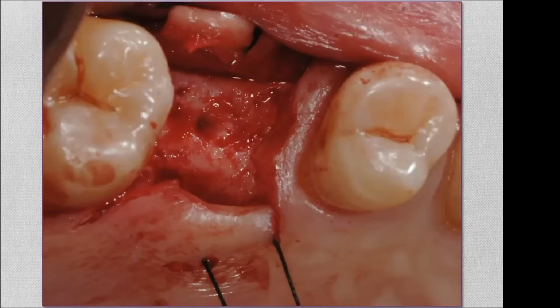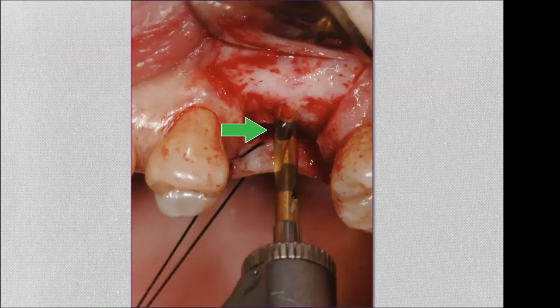okay? We complete our osteotomy, and here, as you see, this is the first black band. So this is 6 millimeter to 8 millimeter. We're getting to about within 2 millimeters of the bottom of this one. So we're at 4 millimeter depth. By our measurements, we have about 5 millimeter depth. So we are keeping 1 millimeter of safe bone away from the floor of the sinus.